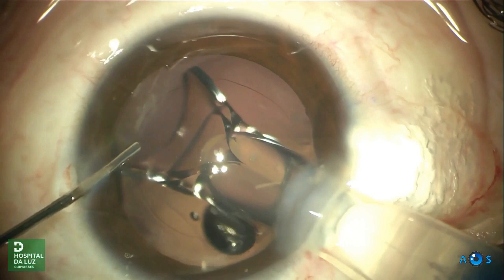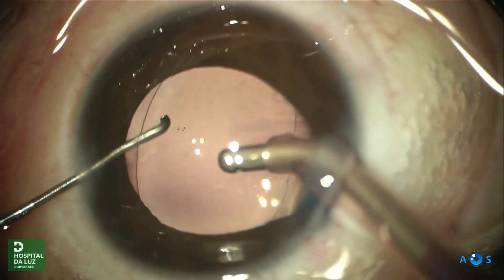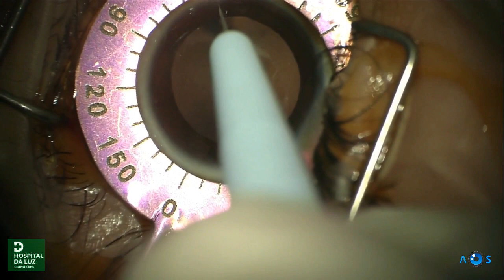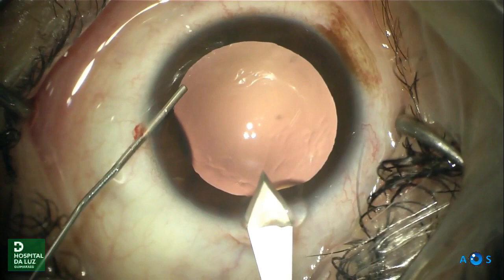Lens implant in the capsular bag was successfully accomplished. We proceeded the same way in the fellow eye.